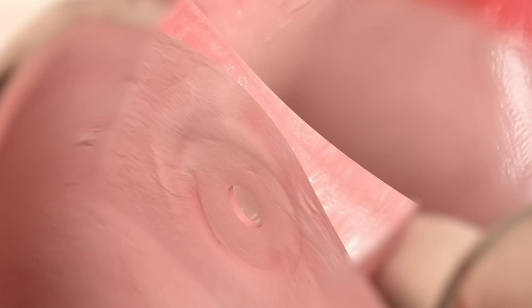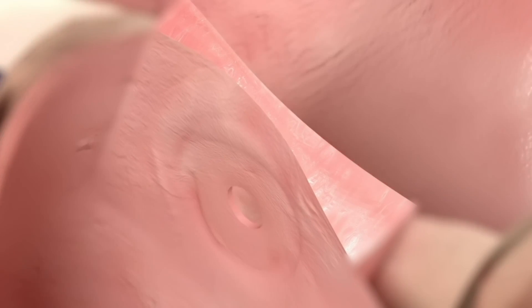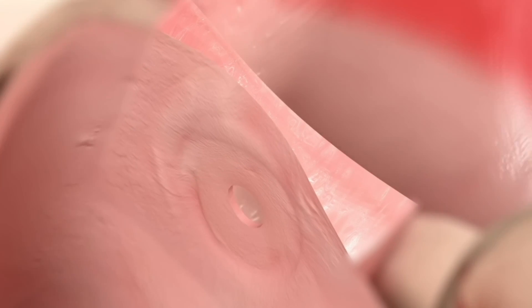As a result, blood is able to flow from the heart's high pressure left side to the lower pressure right side, thereby reducing the excess pressure buildup within the left atrium.